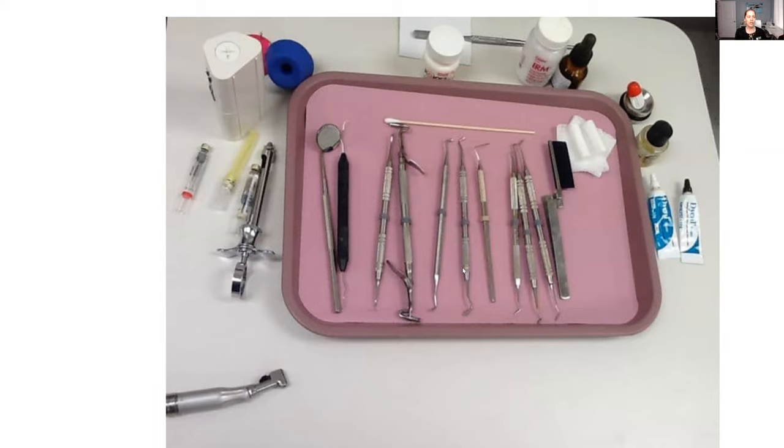For the IRM, you want to set up for a basic filling setup. A rubber dam may or may not be needed. You want to set up the high-speed handpiece, the slow-speed handpiece, the anesthetic, a mirror and explorer. You might also want a bulb burnisher because they might want to burnish the IRM a little bit, a condenser for sure, a PFI — plastic filling instrument — just to help carve it a bit better, a spoon excavator, articulating paper, a Q-tip for the topical before the anesthetic, gauze, copalite, the IRM materials, and the Dical.